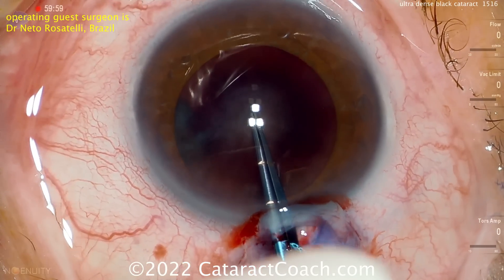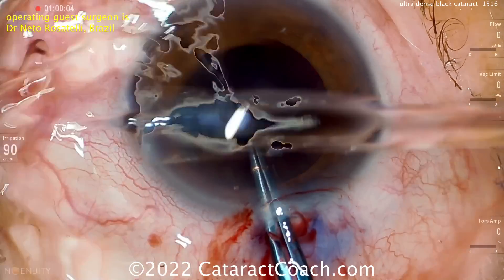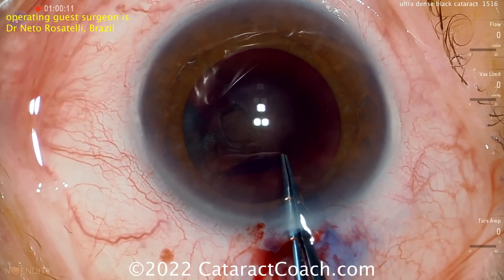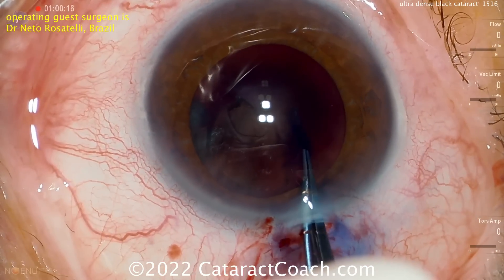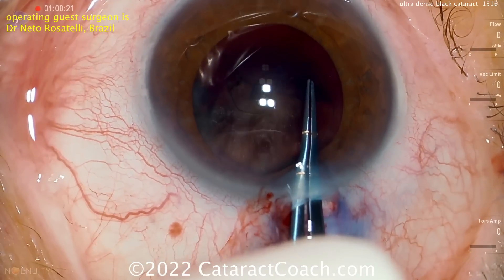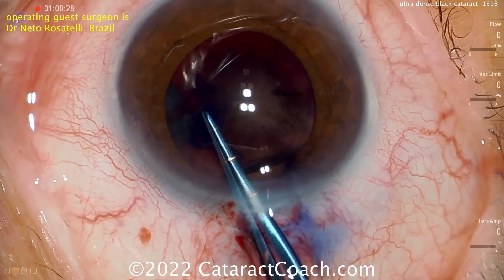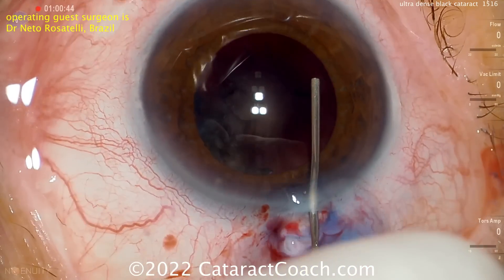As you're going to make a capsulorhexis, you probably already know the saying: do not make a baby capsulorhexis. With an expert like Dr. Rosatelli, you don't have to worry — it's going to be a sufficiently large rhexis. With a very dense nucleus like this, you need room to get it out of the capsulorhexis. You want at least five millimeters in diameter — five and a half would be just about perfect, and I think that's what we've achieved here.